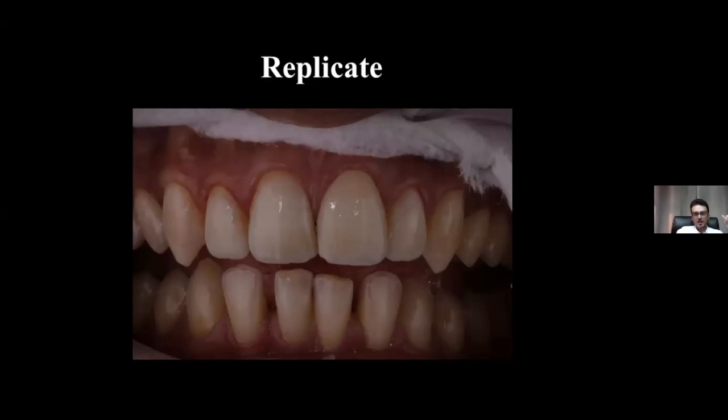And this is the advantage of the intraoral characterization: you see the final results intraorally. You can compare it with the adjacent teeth, and if you're not satisfied, you can change everything and start just from the beginning. It doesn't take more than 10 minutes, so you have all the time to produce a very good restoration.